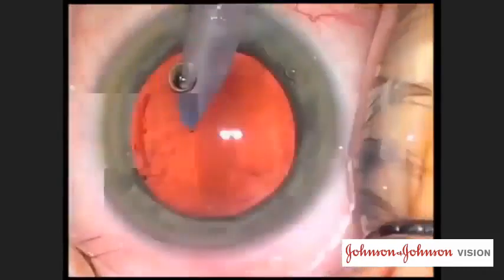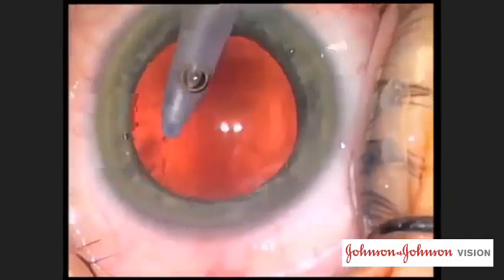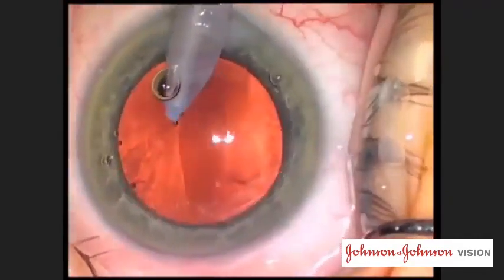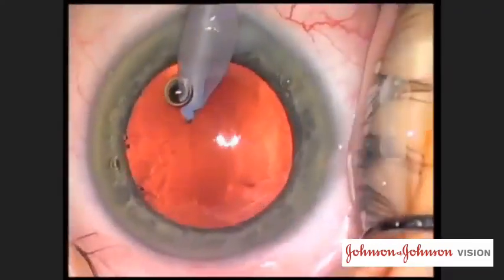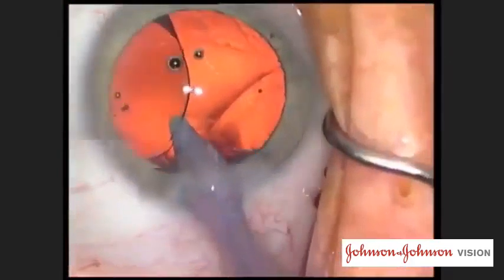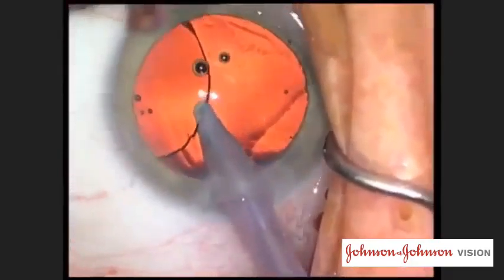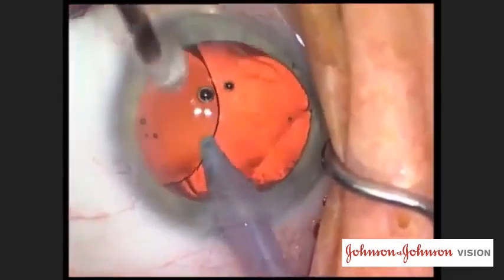During capsular polishing, a PCR developed but was momentarily obscured by the INA tip. The development of this capsular tear is best viewed in slow motion. The day prior, my partner had a similar episode. In his case, the PCR occurred when the aspiration port was turned up away from the posterior capsule.